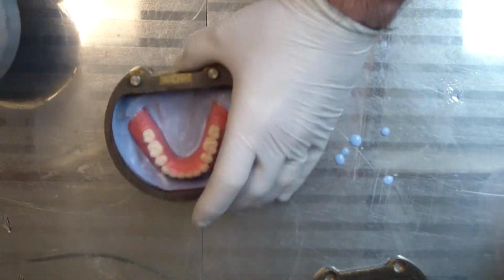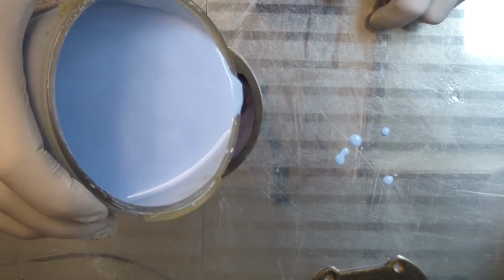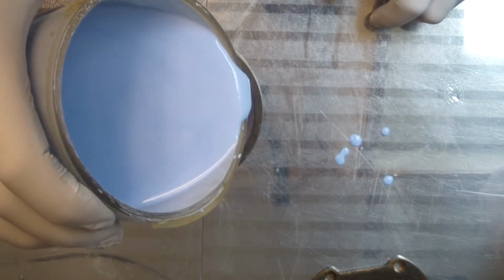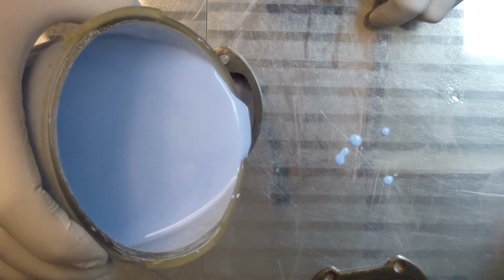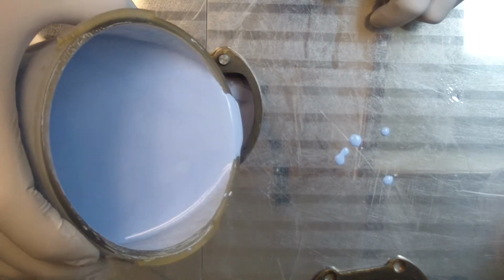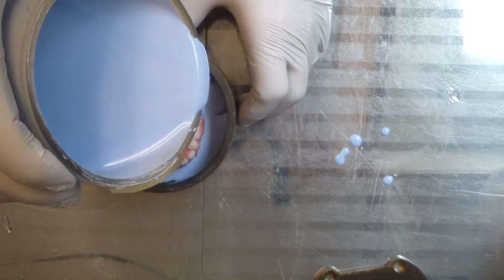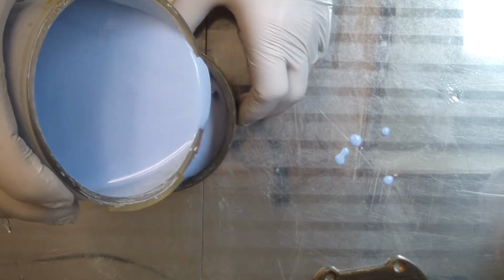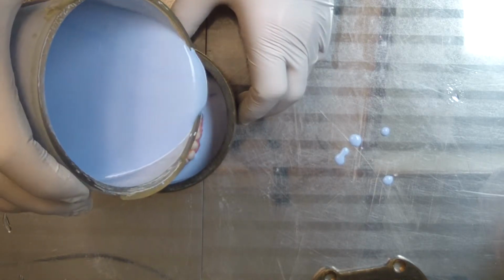That's what I usually do. So at this point I will just take my stone, and what I do is I go from back to forward and I make it really a small stream, and I let it go from posterior to anterior. Gonna go back a little bit so you can see. It's kind of hard to shoot this at the same time as doing it. Hopefully you can see what I'm doing.